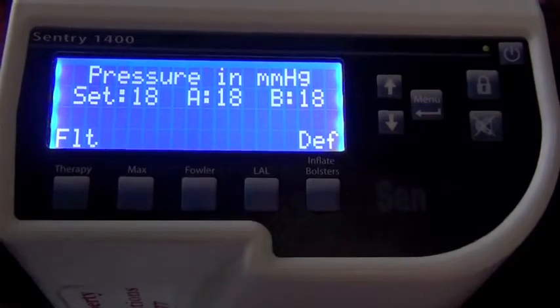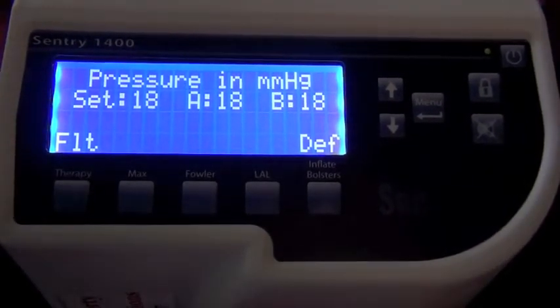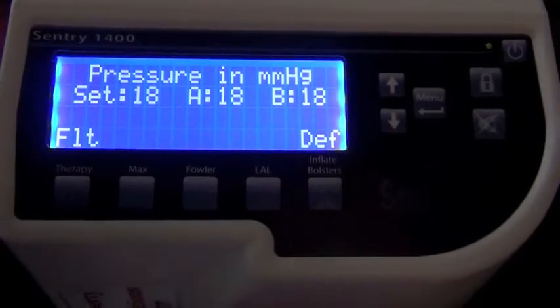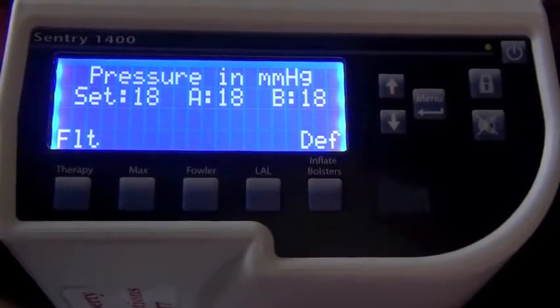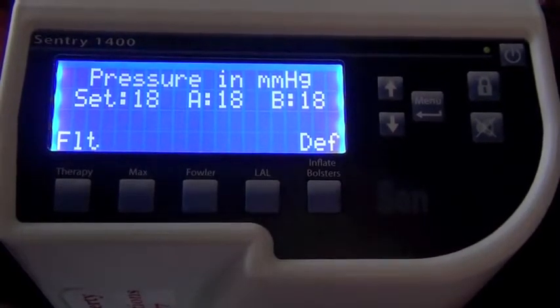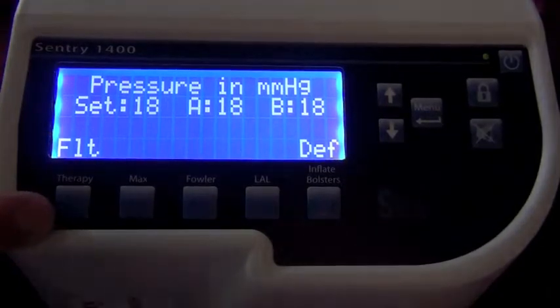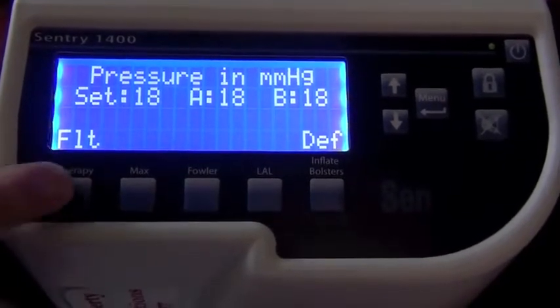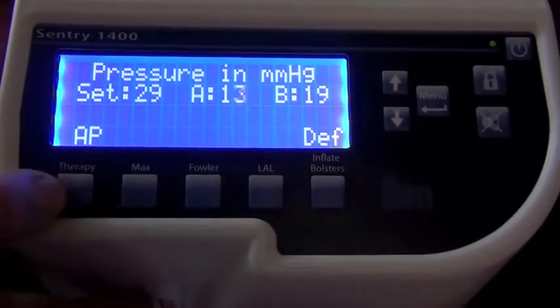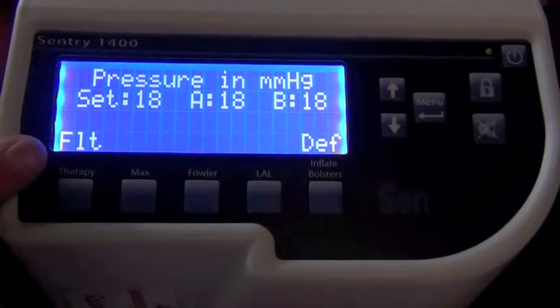And the only way we do that traditionally is by moving. So if the patient's not doing that and they're dependent on us for movement, we're better served with a system that affords us offloading. And that's what alternating pressure therapy does. It offloads tissues. The therapy mode that this is in currently is called air flotation. You have two choices here. We have air flotation and we have alternating pressure. I'm going to start with the air flotation mode.